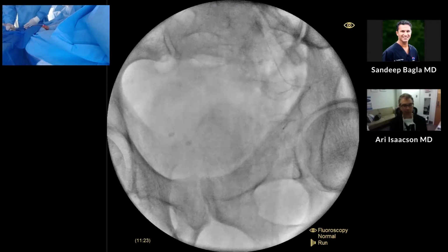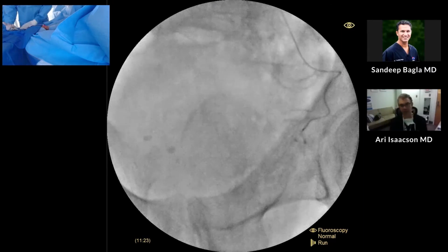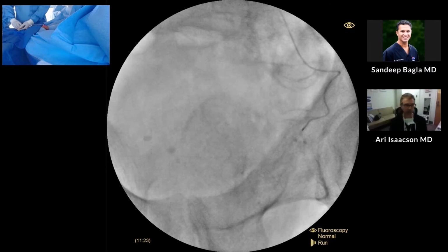Yeah, maybe. It raises another issue though, because when you go to that longer catheter, you also need a longer base cath. Assuming you want your base cath sitting in the hypogastric artery, right? That's the technique that we both use. And that's how you get the best support for advancing your microcatheter. So that's a problem I've encountered, because if you go to a person over 6 feet, your 125 cm base cath may not reach into the hypogastric artery.